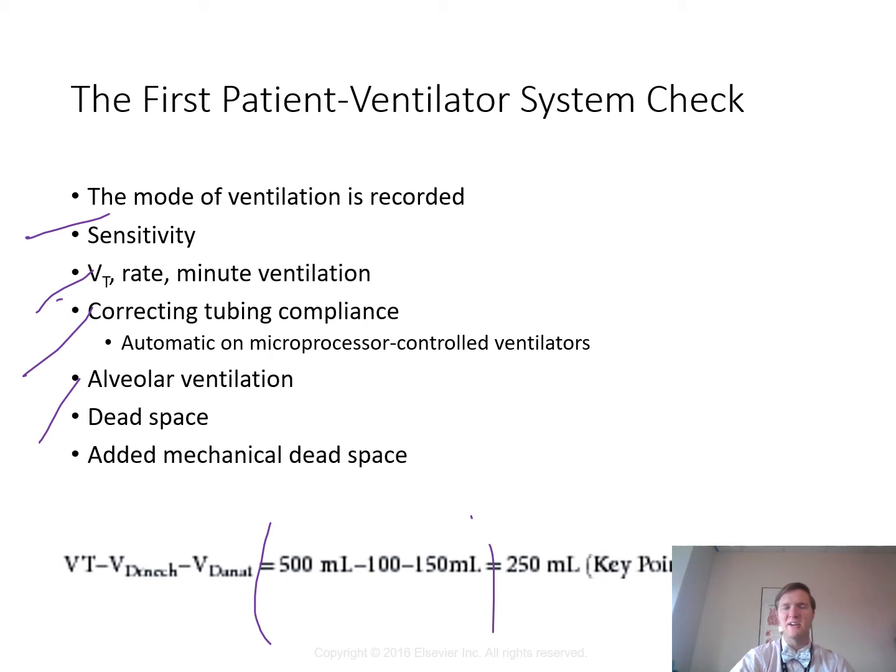But the big thing here is to understand the concept: the more dead space we're adding to that patient, especially the lower tidal volumes we go, the more significant effects it could have on our blood gas becoming more and more hypercarbic. So that's why you might see them trim ET tubes. You might see them get rid of a bunch of dead space in those patients on very low tidal volume strategies to help do that, or change from an HME to a humidified circuit.